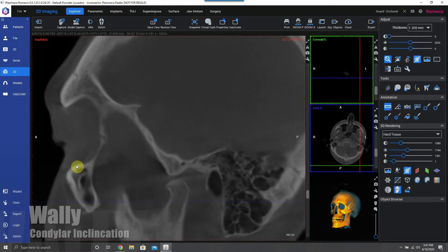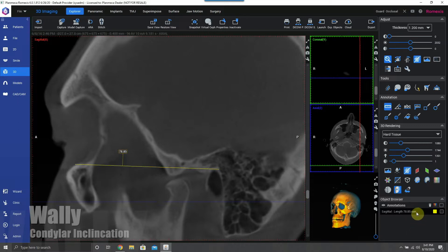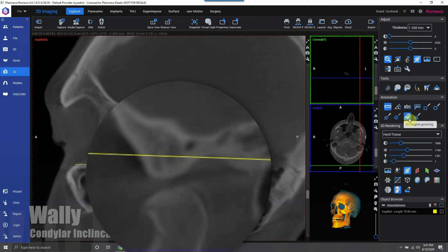Basically, we're going to pick the inferior border of the orbit and the superior border of the external auditory meatus to drop a Frankfurt horizontal plane using the drop-a-line tool in Romexis software. Here it is, and I just changed it to yellow.